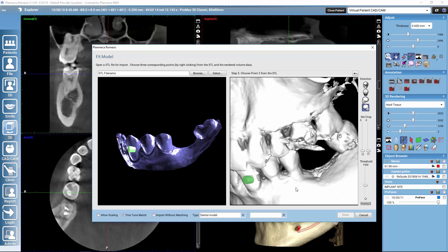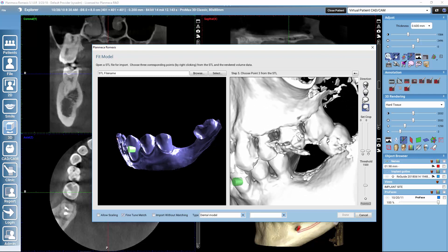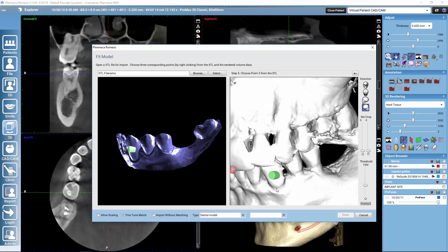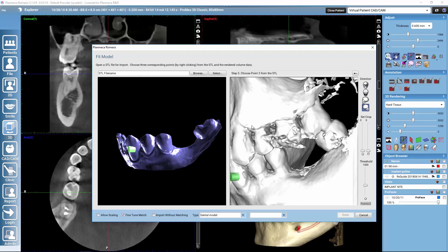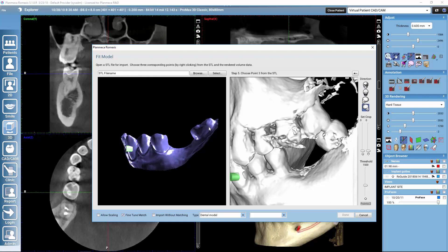The further away the points are, the more probable it is that our match will be good. I try to select the points as far away as I can, but there is one limitation: if there are a lot of artifacts on the posterior area, you want to avoid those areas and not select points where there are a lot of artifacts. In this case we don't have too many artifacts on the molar area, so we can select the third point from the molar.